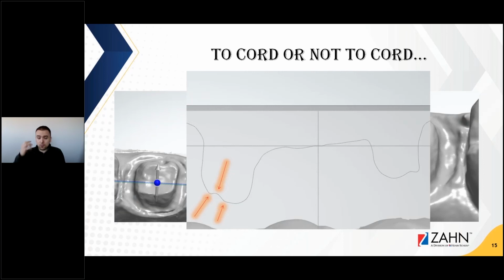And that's one of the main challenges that we have, especially when we pick up a lab that receives a lot of intraoral scans from some of these other scanners, in situations where the dentist didn't pack the cord, and so it's kind of difficult to distinguish that. But we do our best, and we try to work with the dentist and the labs as much as we can to alleviate that.